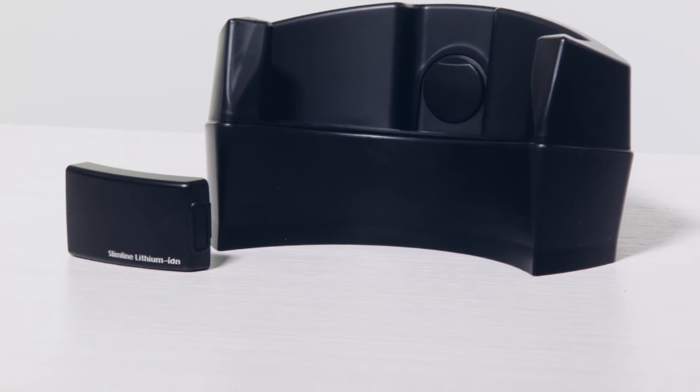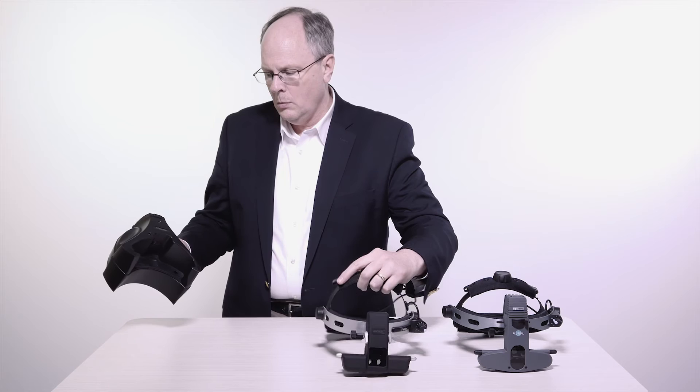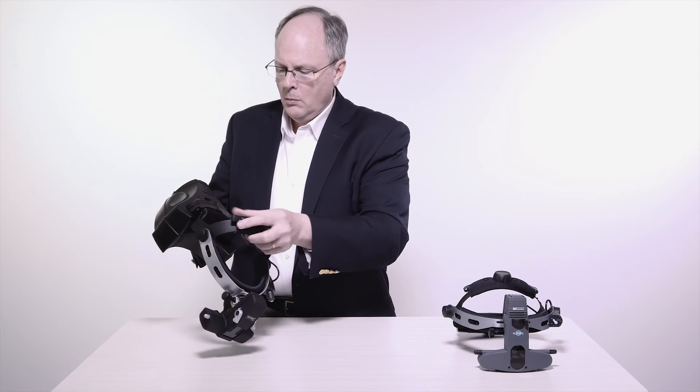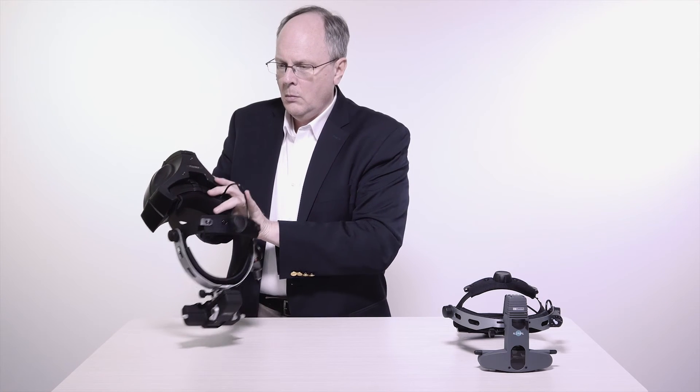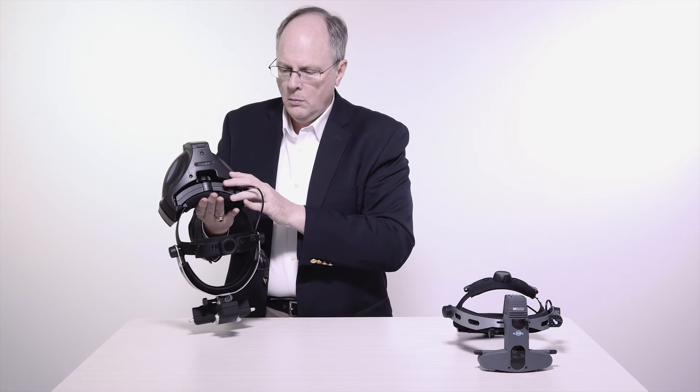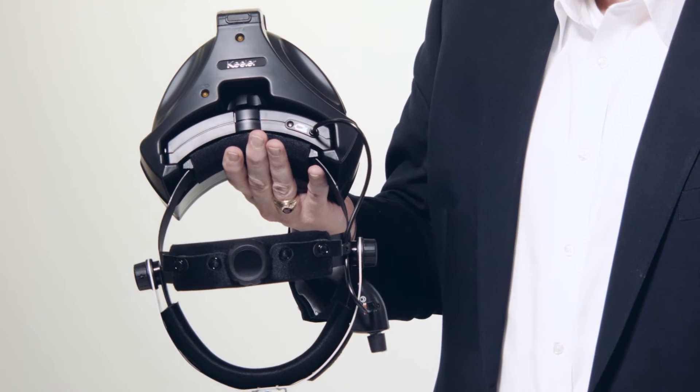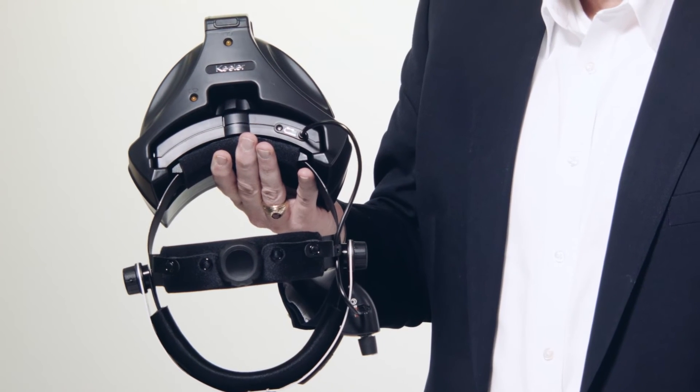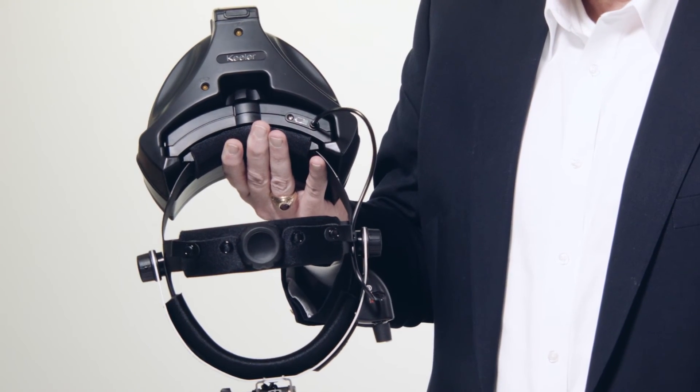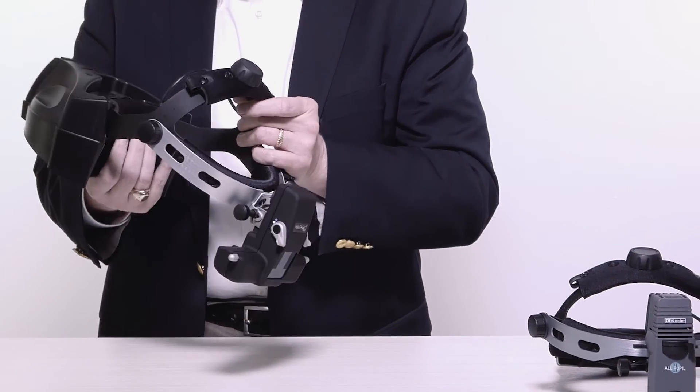The docking station can sit on a table or be mounted on a wall. It is powered using our universal switch mode power supply from 100 to 240 volts. The indirect is recharged and automatically turns off the illumination when you place it back into its charging station. Both batteries are charged simultaneously.